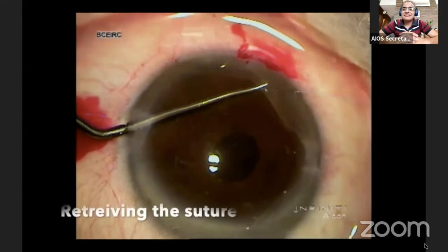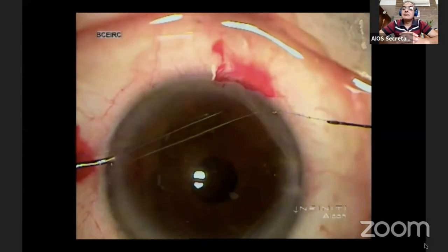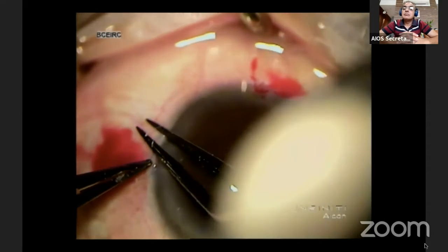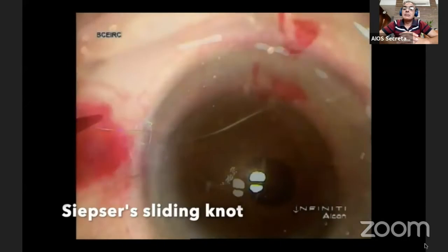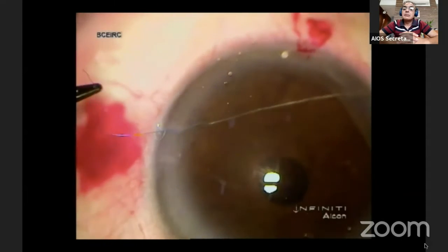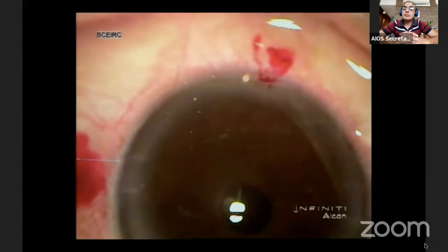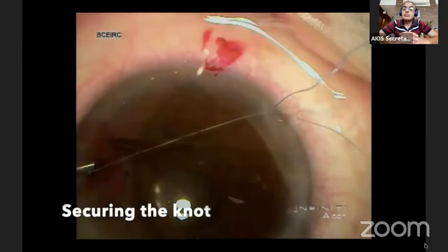The suture is then retrieved from the distal end into the proximal side port. A knot is tied outside which, when pulled, slides into the eye — that is the Sipser's sliding knot. The knot grips the haptic of the IOL to the iris.